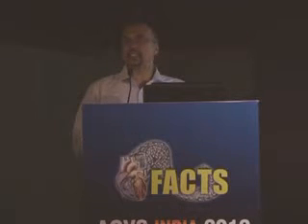Once you see that the right coronary ostium is not in its usual place, you just go back to the left, or go very close to the left with the Tiger catheter, rotate anticlockwise a little, and almost always you are seated in the posteriorly arising right coronary artery. This is the most common anomaly, and it is very easily cannulated transradial with this catheter.